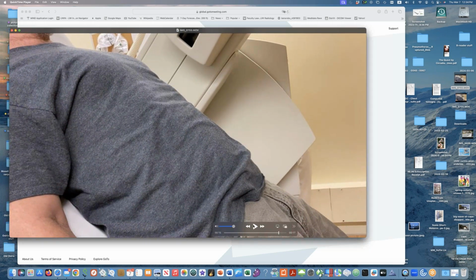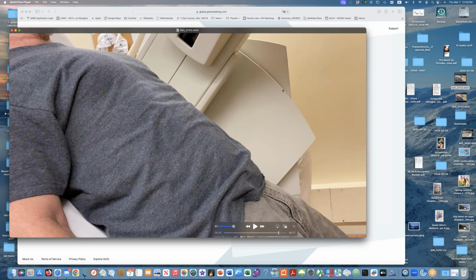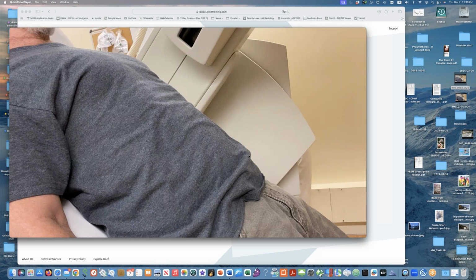So this is a very dramatic example of how normal things can look on standing views. But if you stress the diaphragm by putting the person supine or by sniffing, you can see this paradoxical motion. Sniffing is one stress test, and supine position is a potent stress test too, and it really brings out these cases of bilateral diaphragm paralysis that you might miss if you just had standing views. So I was really happy to be able to get this nice video of abdominal paradoxical motion here.